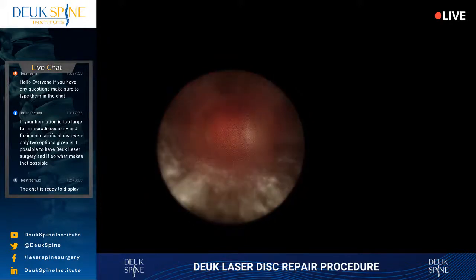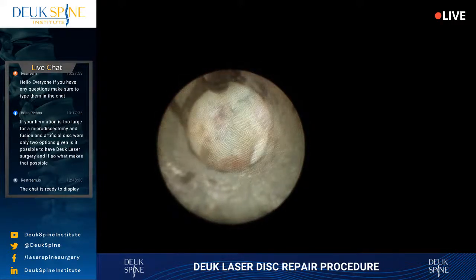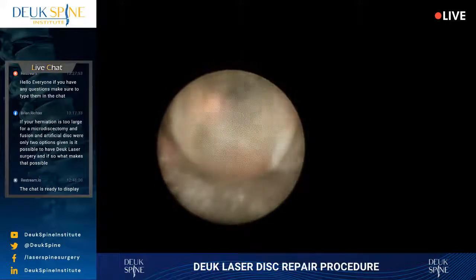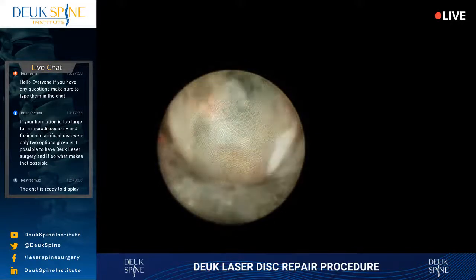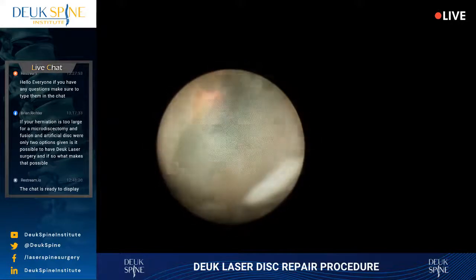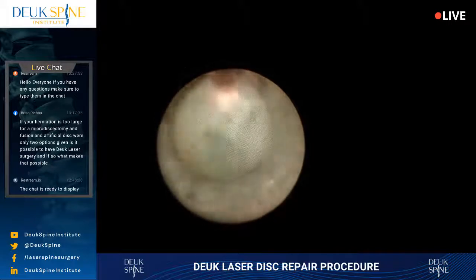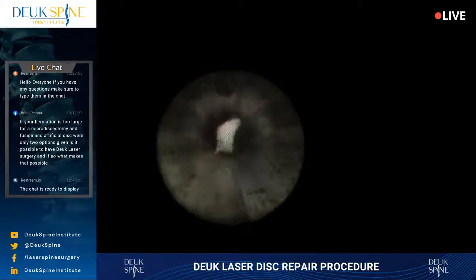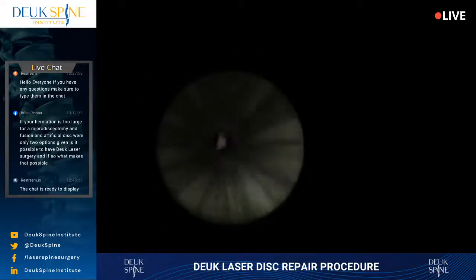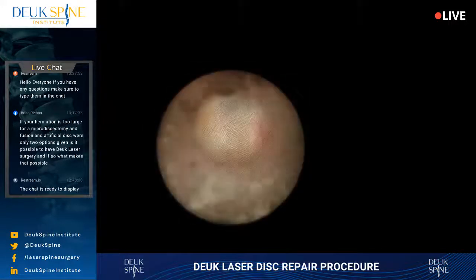Anyway, the laser itself is 0.5 millimeter wide. So that glass pipe is only 0.5 millimeter wide. What's cool is that the beam comes out of the end, again, only 0.5 millimeter. So the actual thickness of the laser is 0.5 millimeter, and the working distance is 0.5 millimeter. That's important to keep in mind, because it's not like Star Wars where they shoot laser guns and they go across the room. The laser energy is dissipated in 0.5 millimeter distance.